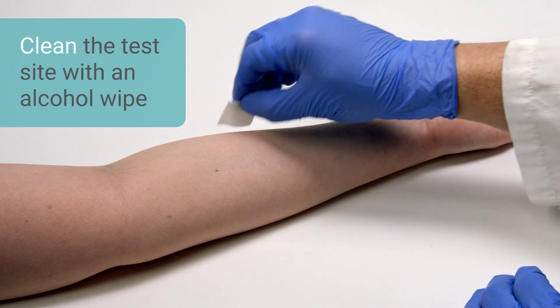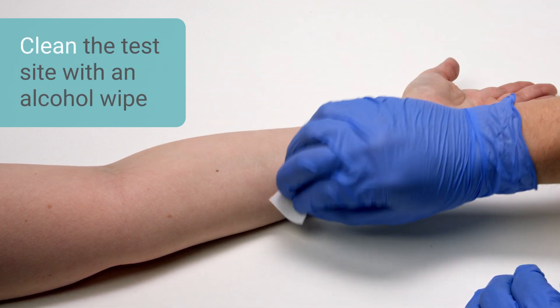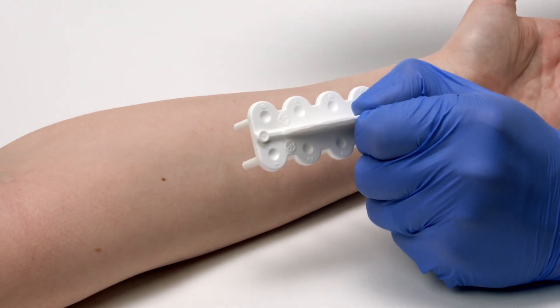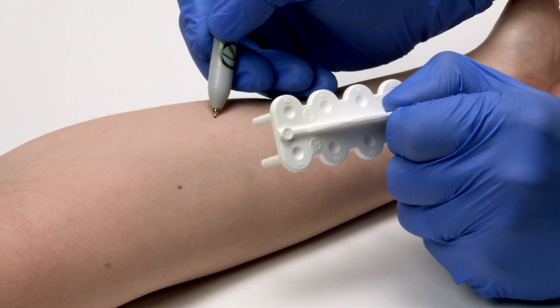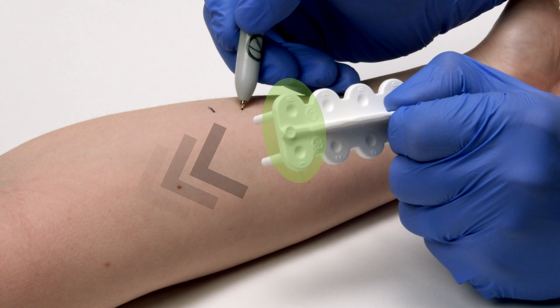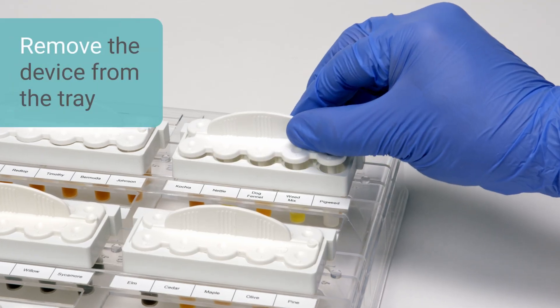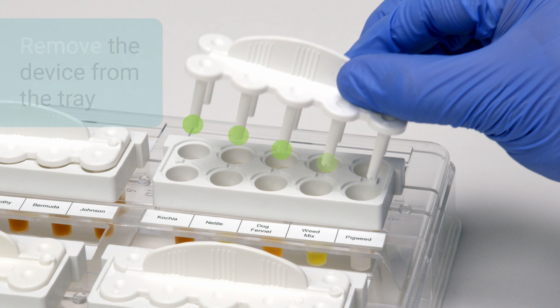Clean and dry the test area on the patient with alcohol. Always place the test device handle with the small indented circle plus the numbers 1 and 6 facing upward and toward the patient's head. Carefully remove the device from the prepared tray. Take care not to touch the tips on the reservoirs or spacers.